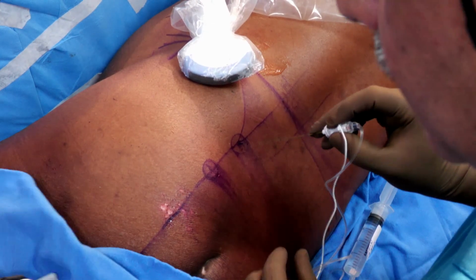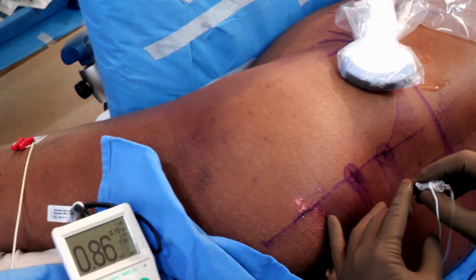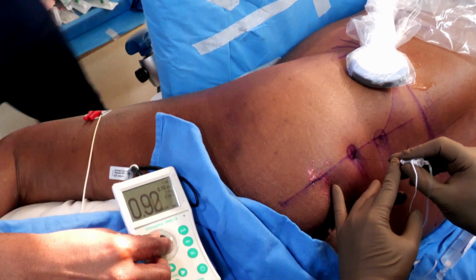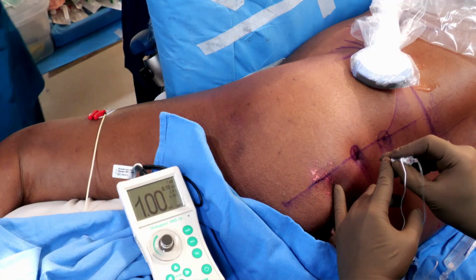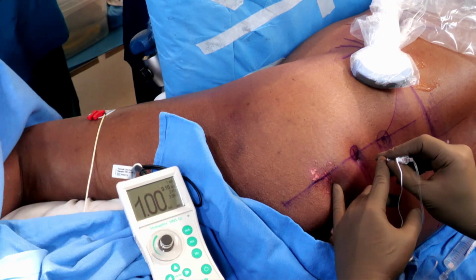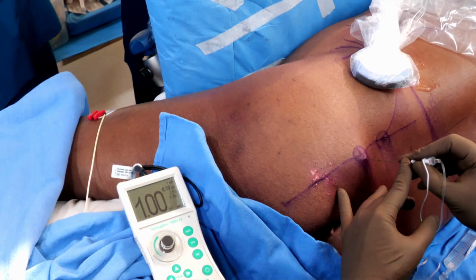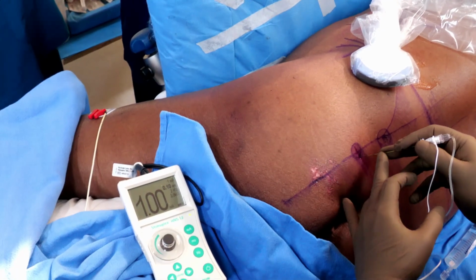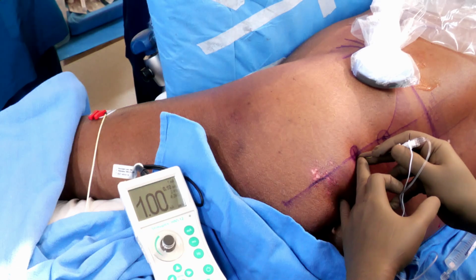I need to see that. So we are through the skin and subcutaneous tissue. You can anticipate gluteal contractions if I'm on the right path. It seems I've hit the bone. So I have to make sure that I don't go beyond that, 2 centimeters beyond that.